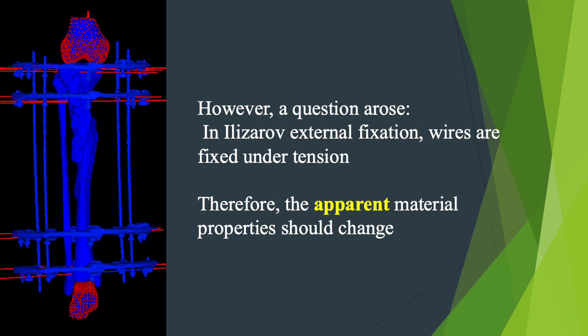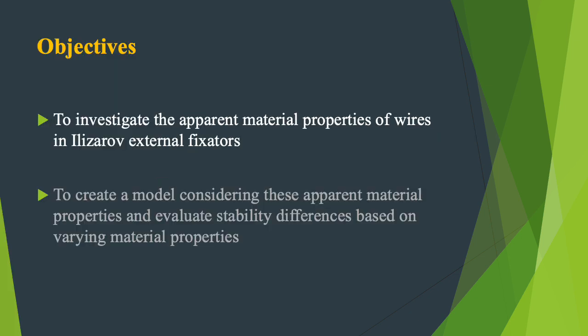However, we encountered an interesting consideration. In Ilizarov external fixation, the wires are fixed under tension, which means the apparent material property should change. Our primary objective was to investigate the apparent material properties of wires in Ilizarov external fixators.